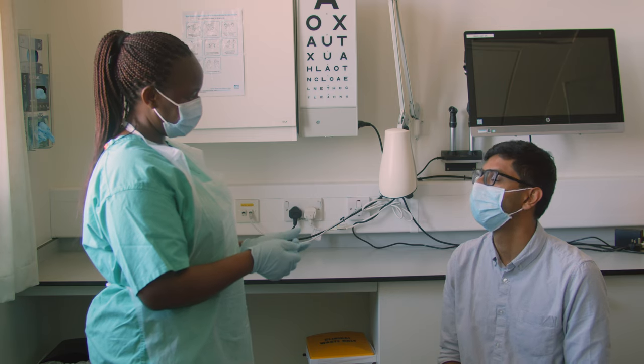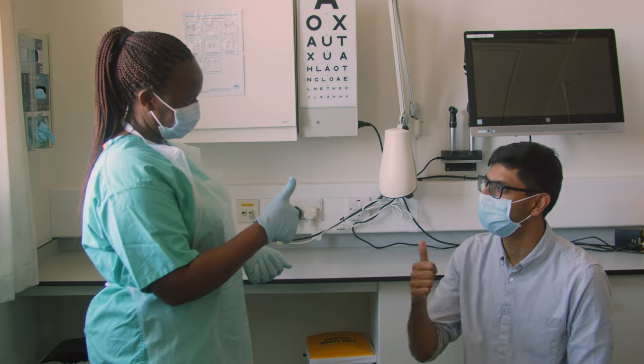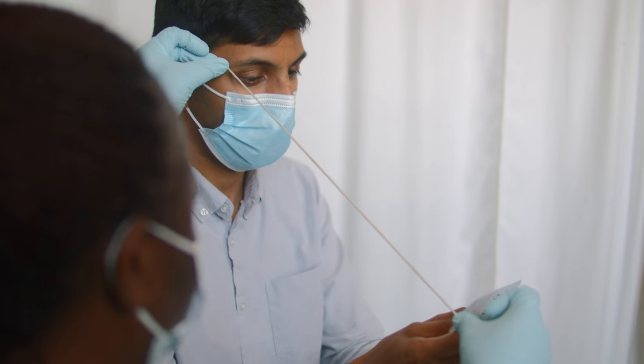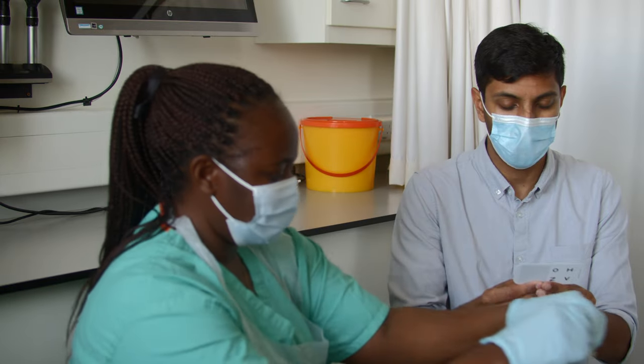Explain what you're going to do and gain consent. Sit the patient comfortably in a well lit place. Use the string to make sure the chart is held at the correct 40cm distance.